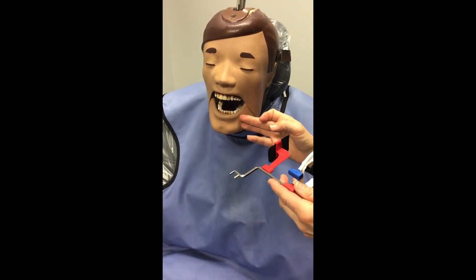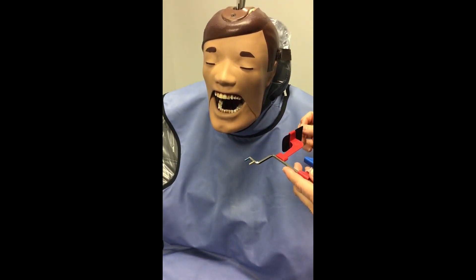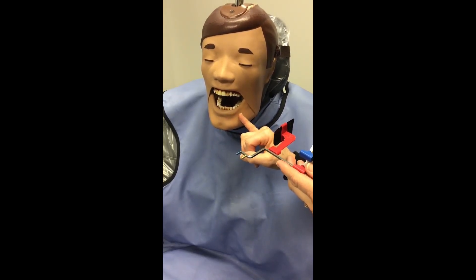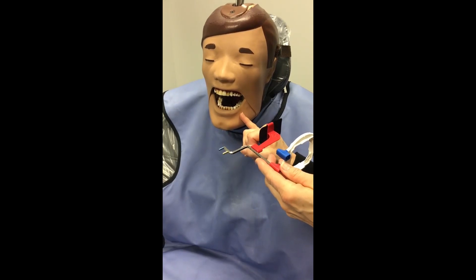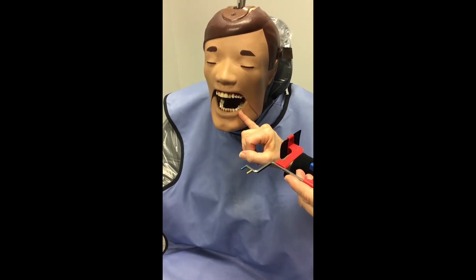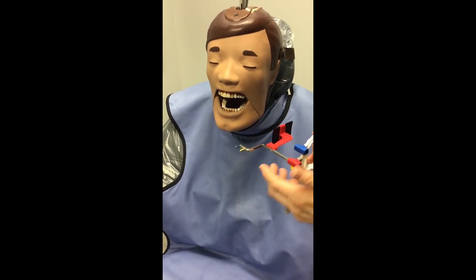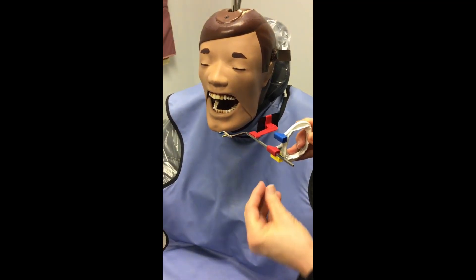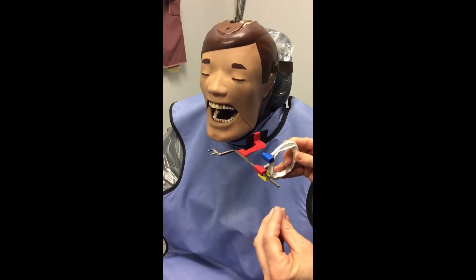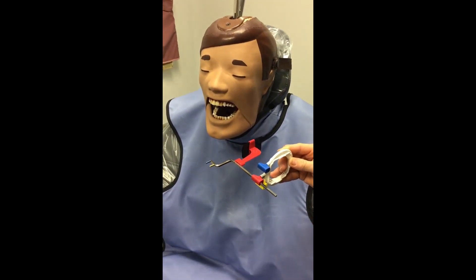For a premolar bite wing projection, you want your two premolars on the projection. The criteria requires half of your canine on your premolar projection — if you have half of your canine, you'll automatically have your whole first premolar. When placing the PSP plate in the mouth, look for the front of the plate to come up and touch the space between your mandibular centrals. That way you're guaranteed to get the distal of your canine and your two premolars.